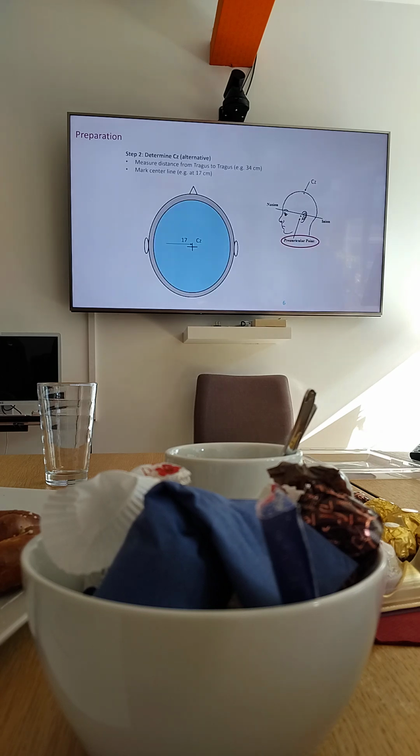You measure one more thing, because with every set you have something like this. You measure also the circumference. Circumference, excellent, I didn't know. You put these three figures on the cap of the patient, so you have these three pieces of information, because later you have to put these figures into a software, and this makes a calculation for you. All right, so far so good.